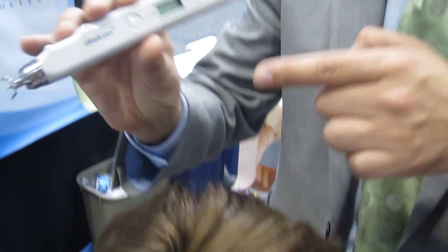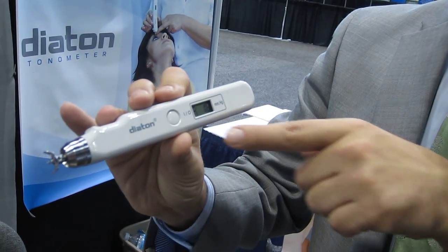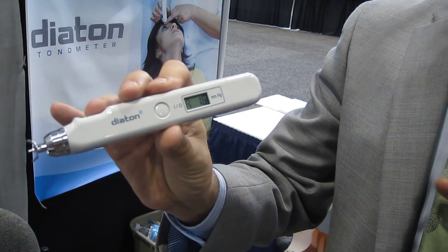Take the third reading. The device gives you a long beep. We took three readings, pressed the center button, and we get the average of the last three readings.